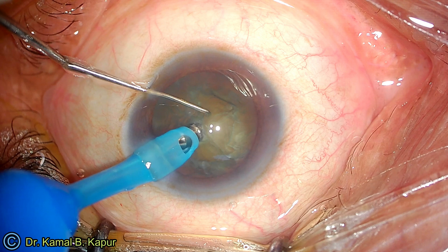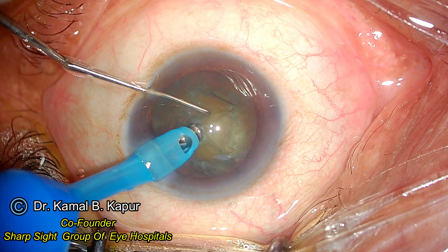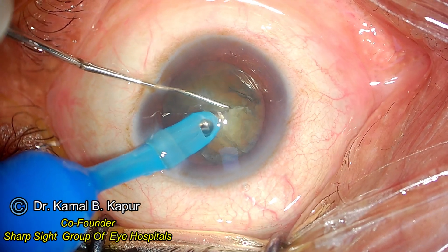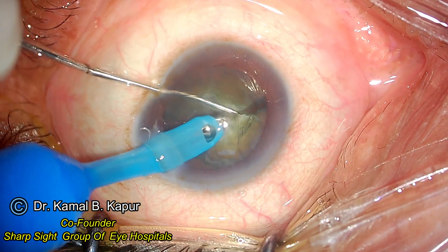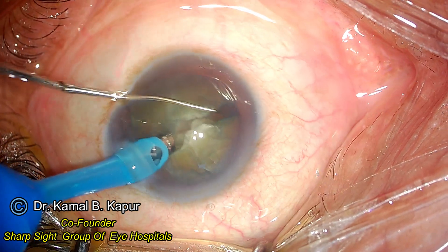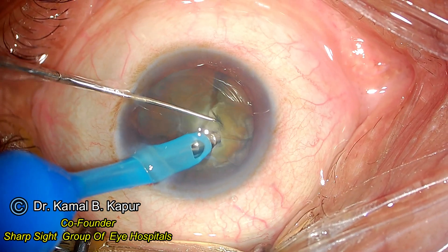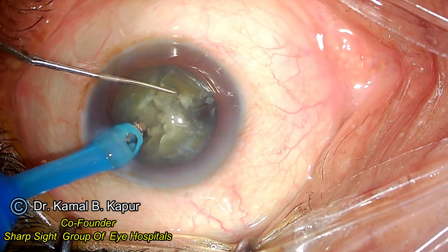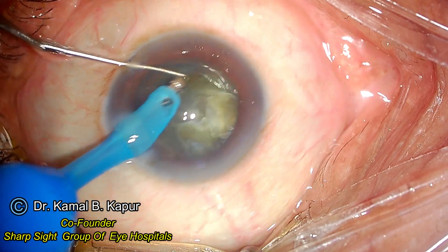Now let us review all the discussions done previously. Notice the FACO tip embedded into the center of the nucleus approximately 50% into the length and depth of the nucleus. The chopper is embedded right in front of the FACO tip while being pushed down. You embed the FACO tip, embed the chopper right in front of it, and separate both of them. Remember that your FACO chopper has to face totally downwards, hitting into the depth of the nucleus, and then performing the same step for the D segment which was created.